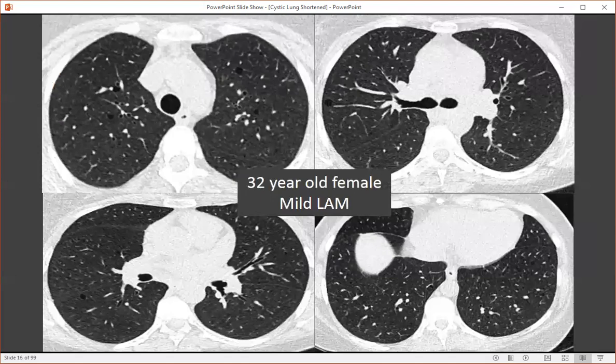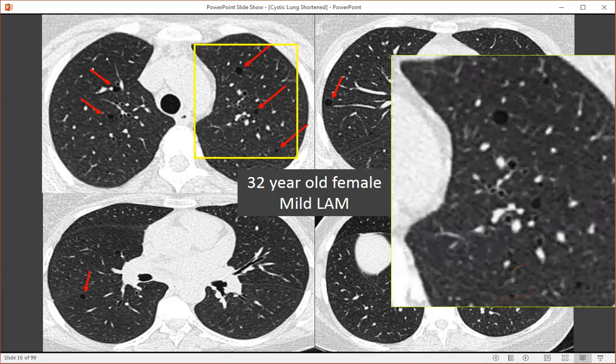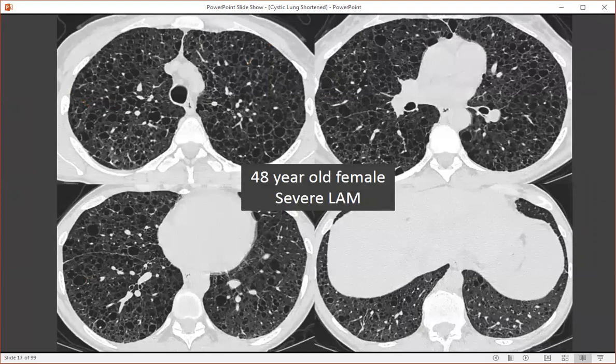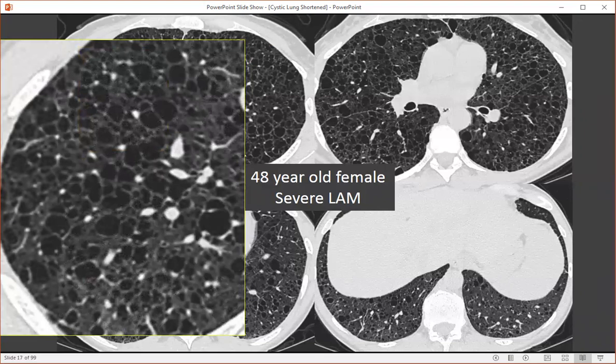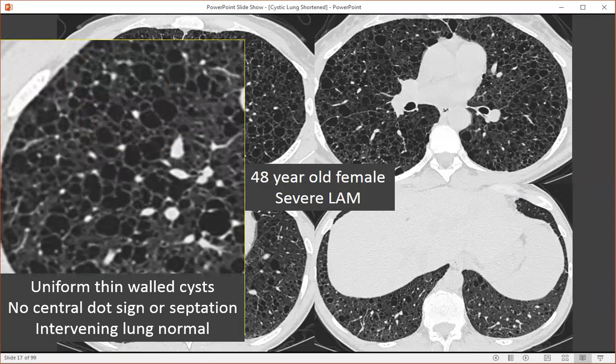Here's a 32-year-old female with a mild case of lymphangiomyomatosis. We see several small cysts within the lung parenchyma that are uniform in shape and size with regular thin walls. And a 48-year-old female with a history of severe lymphangiomyomatosis — when we look at these cysts, they're fairly uniform in shape, size, and distribution, affecting all portions of the lungs. There are no intervening septations or central dots sometimes seen with emphysema, and importantly the intervening lung is normal.